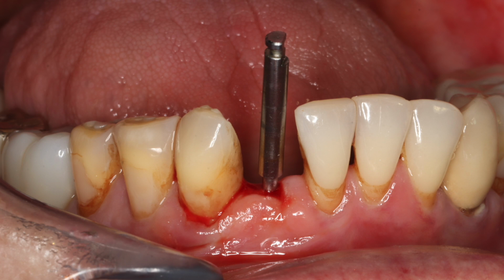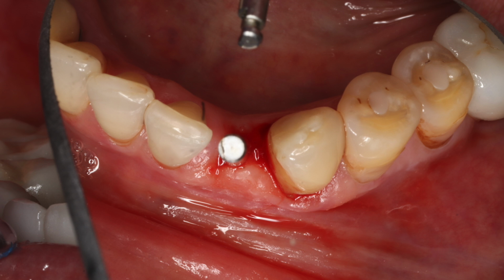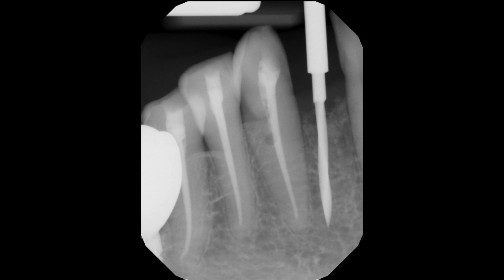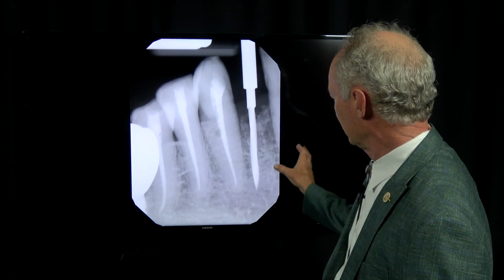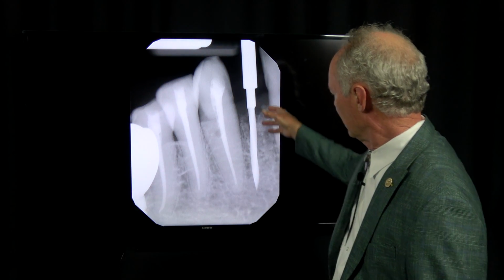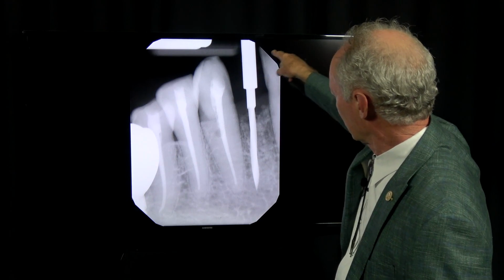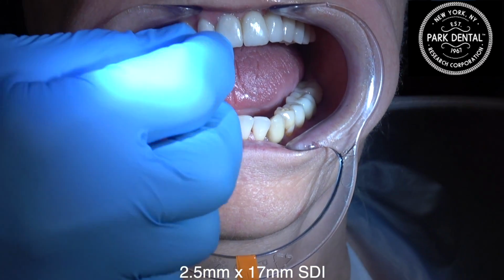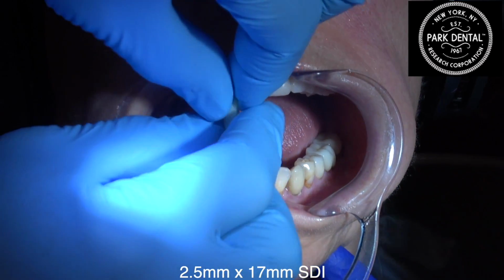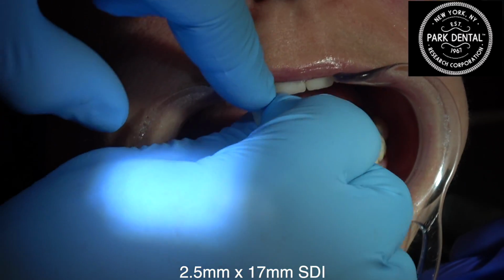It's a pretty delicate drilling operation when you've got teeth in such close proximity. Okay, so see, we're good here. It may be an angulation issue, but when I'm placing the implant, as I screw it in, I'll kind of move the top part of the implant to the cuspid side or the distal, which kind of moves it to the mesial, but that's fine right there.